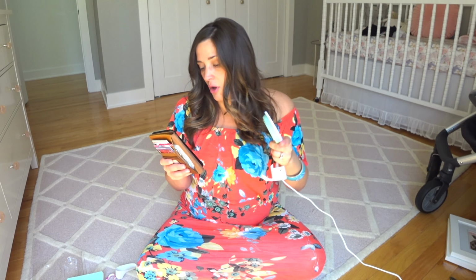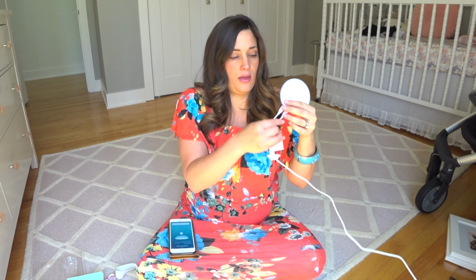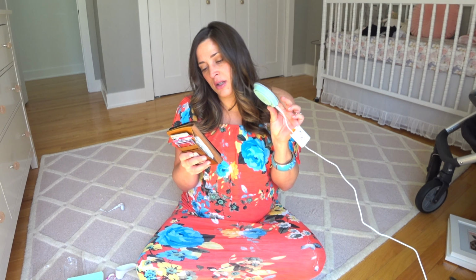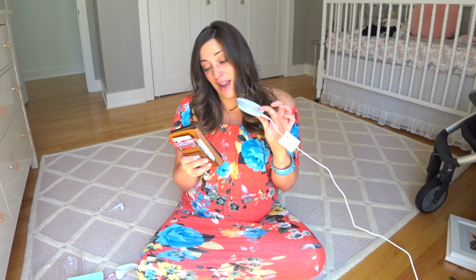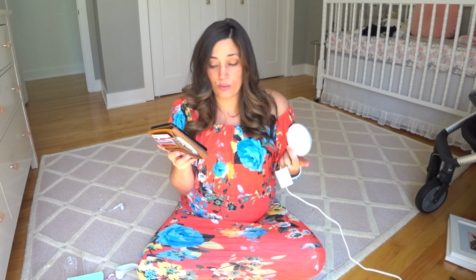Flashing blue, oh, we can test this. The smart sock is out of range or the signal's being blocked. Let me unplug this and see if we can test it. Flashing yellow, the smart sock has fallen off or is improperly placed. Flashing red, heart rate and oxygen levels are outside specified limits. So I guess you will get that alarm, which is great.